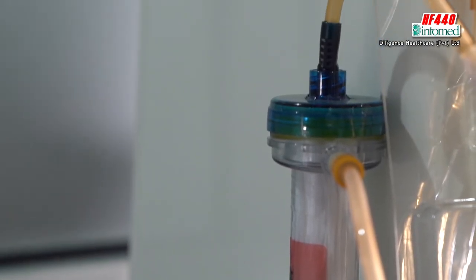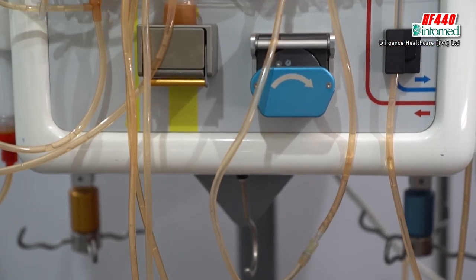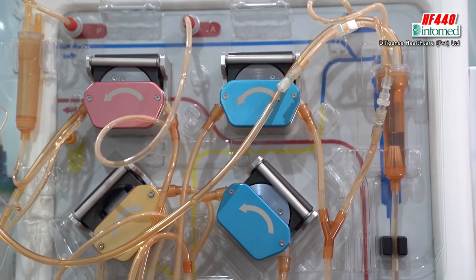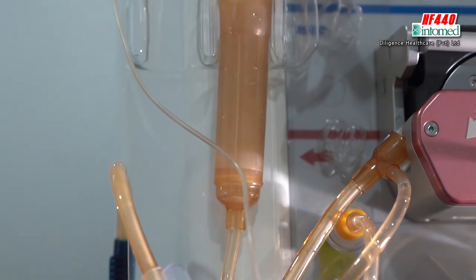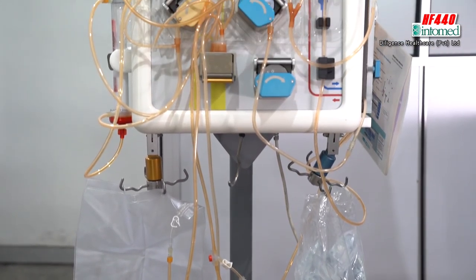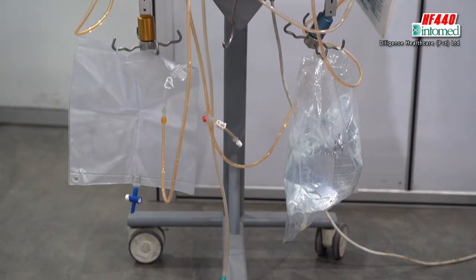Gradually increase and at least reach a trial level, best to reach 150. If the 150 level is okay or something closer to that level, you start the therapy. At that time, you have to input what the UF is, what the weight loss is, what the dialysate flow is, and what the substitution flow is. According to the therapy, insert those data and start the therapy.